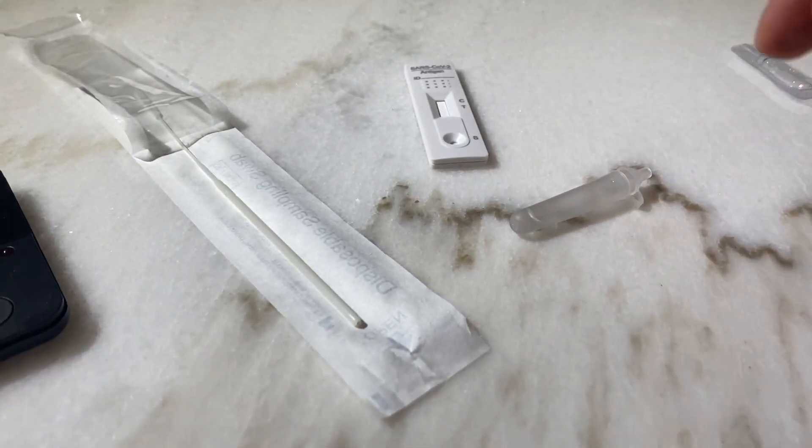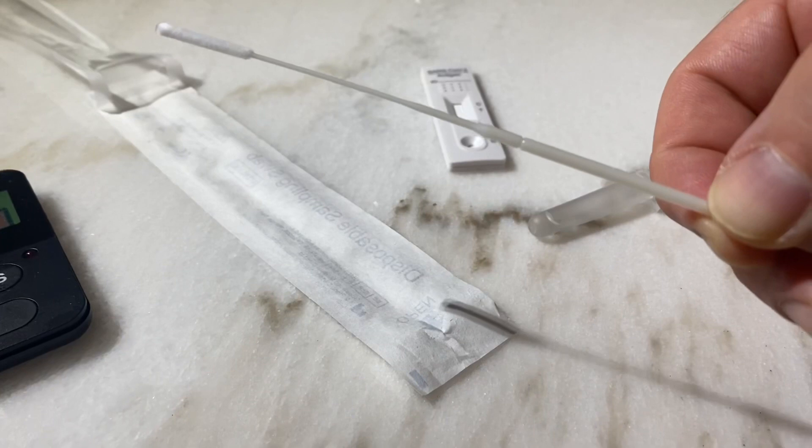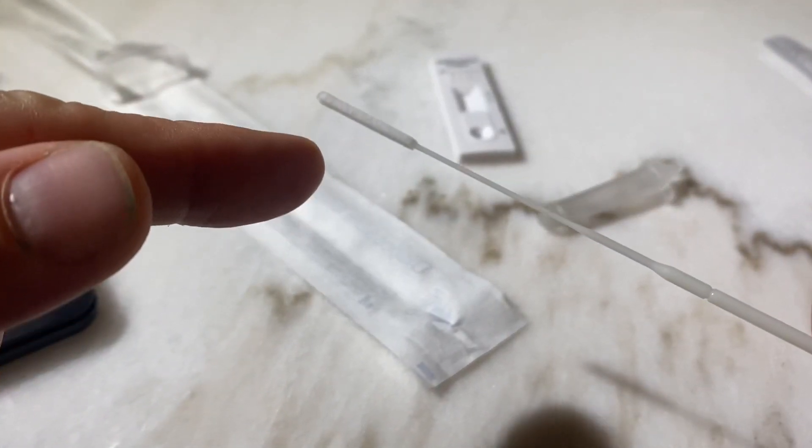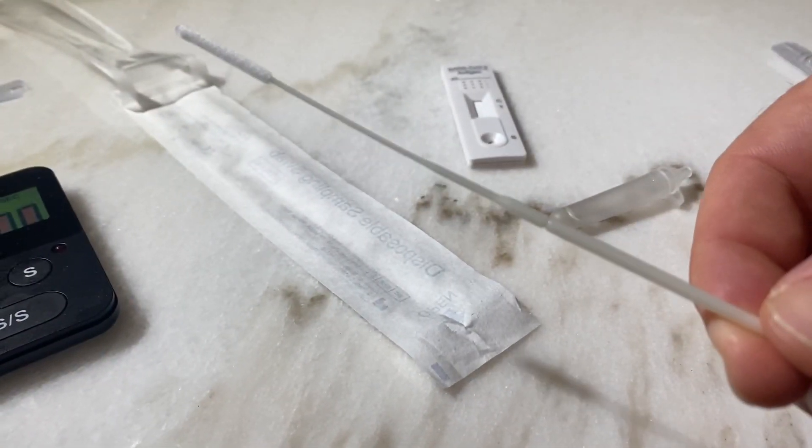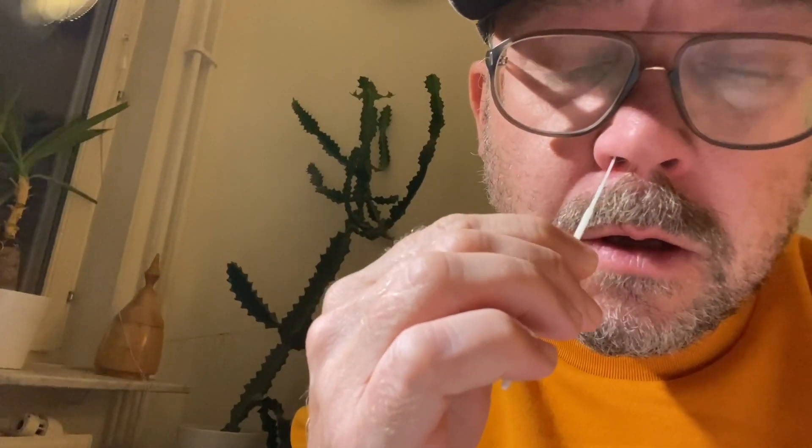Now I'll show you how to insert the cotton swab into your nose. This is the part that goes inside your nose — this is the cotton swab, this is the handle. We stick this into the nose: it's very unpleasant, but it should go in 2.5 centimeters. Then you roll it around inside, and then you switch to the other nostril and take the second side. Wow, that feels bad.